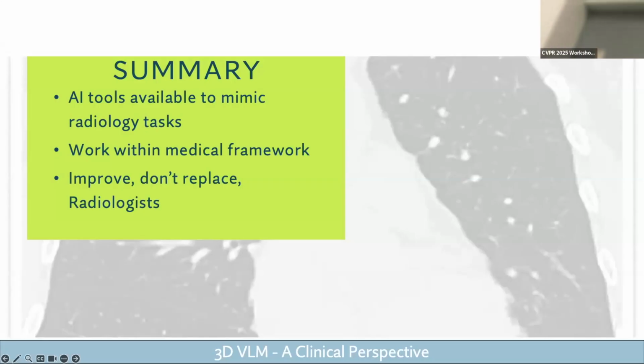Yeah, so I would frame this in the context of something that we as radiologists have been doing for 100 years, but replace AI with resident. So I think everybody is familiar with that workflow and realizes that there can be potential bias. But you try and remain independent. Some radiologists will deal with that by looking at the study before they read the resident's report. Some feel comfortable because they know and trust the resident. They'll look at the report or skim the images, and then feel comfortable signing off. So I think that's there.